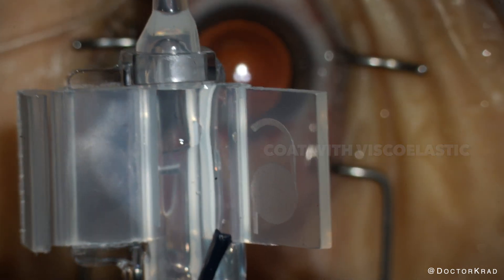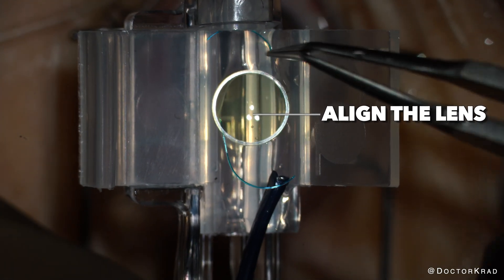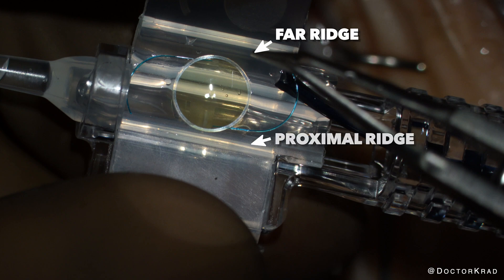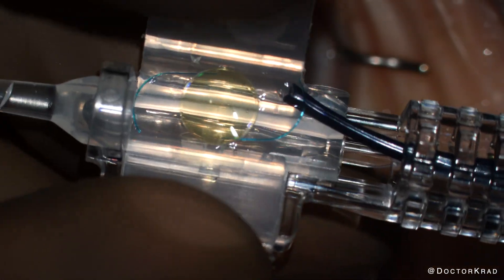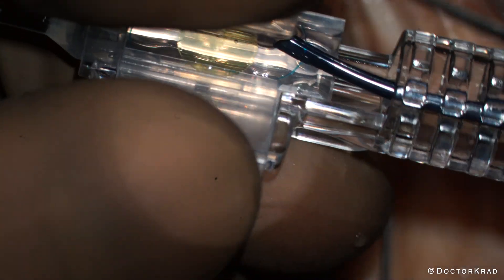After coating the cartridge with viscoelastic, you lay down the light adjustable lens on the platform, similar to the image of the IOL on the wing of the cartridge. Prior to folding the wings of the cartridge, you've got to make sure that the optic is sitting underneath the ridges adjacent to the wings. The easiest way to do that is to push the IOL away from you under the far ridge, and then as you fold the wings, make sure that the proximal optic edge is underneath the proximal ridge. That will make sure that the IOL does not float up as you fold the wings.